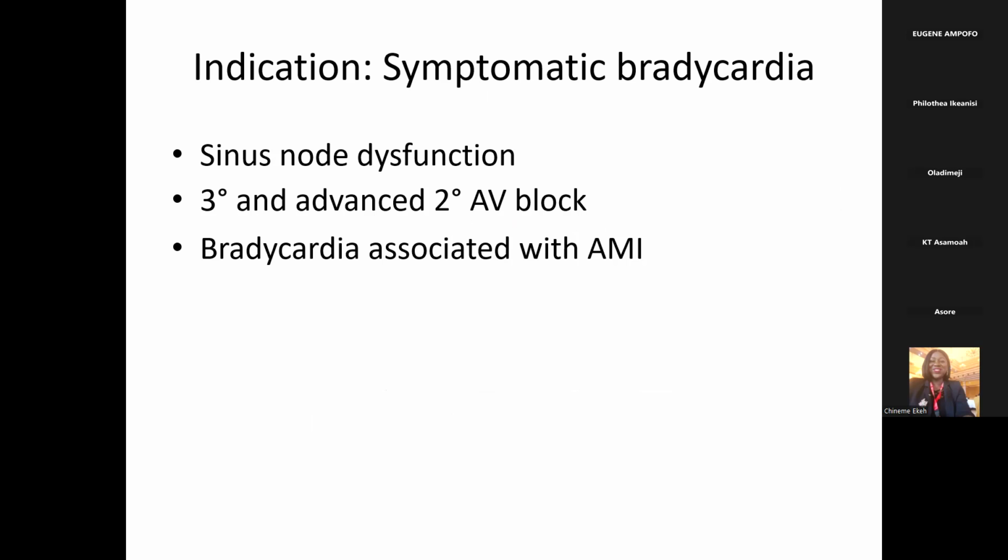So, indications for pacemakers: we all know that pacemakers are for bradyarrhythmias, either from SA node bradyarrhythmia or AV node bradyarrhythmias. One important part is that it can be used in sick sinus syndrome, where the patient has a tachy-brady syndrome. The tachy part you treat medically with medications, beta blockers basically. The brady symptoms of it will be treated with a pacemaker.